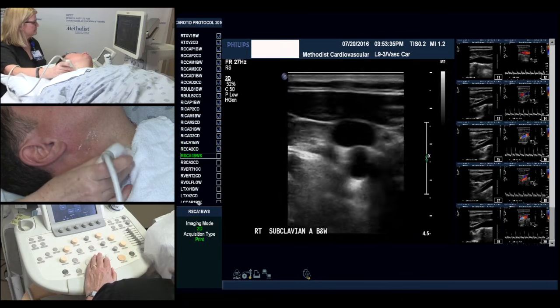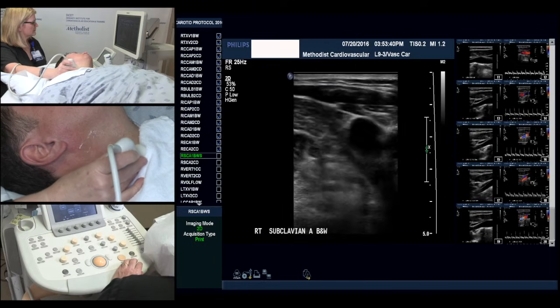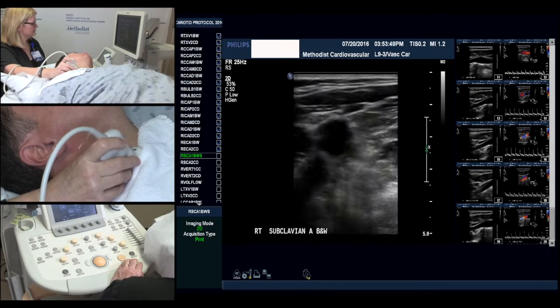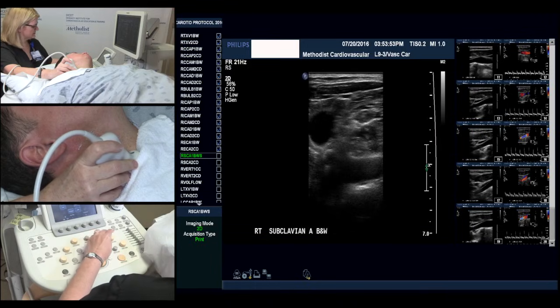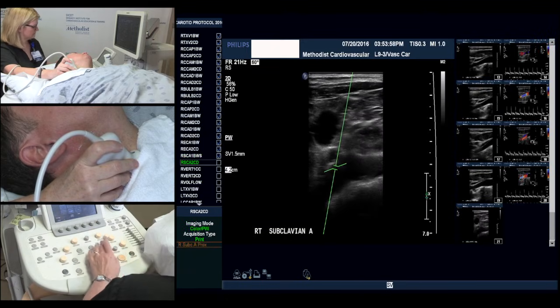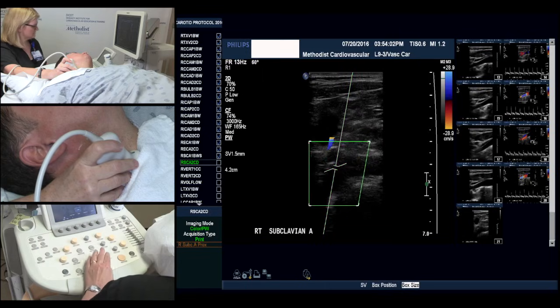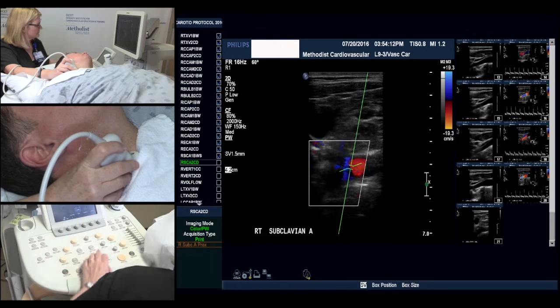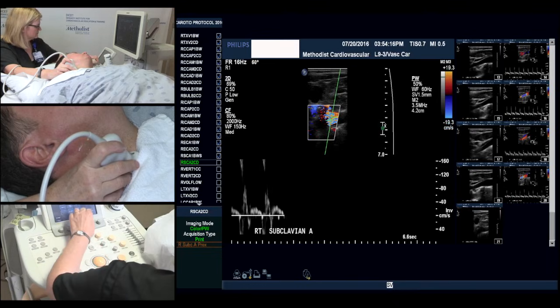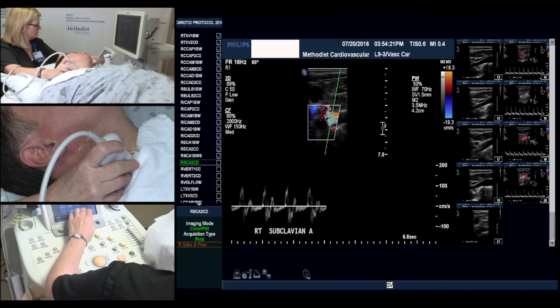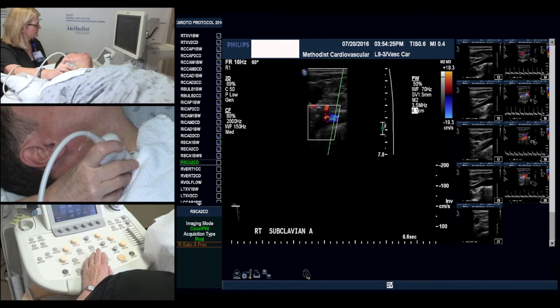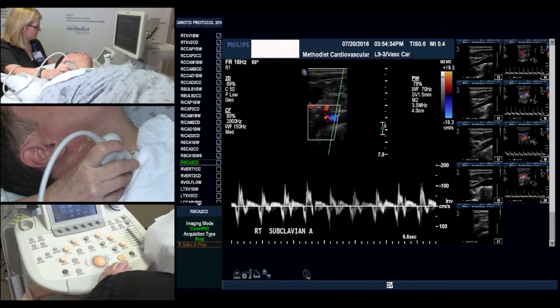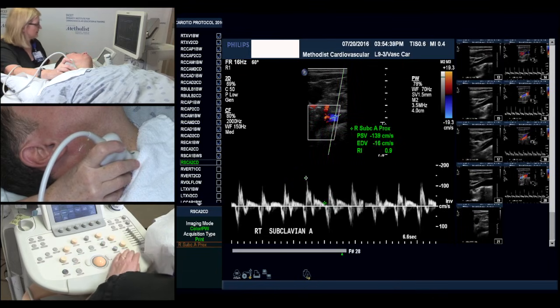From here we'll go to our subclavian. Go back into a transverse approach and we angle down towards the clavicle, adjusting our focus. We'll adjust our scale for color filling, and again obtaining our velocities.